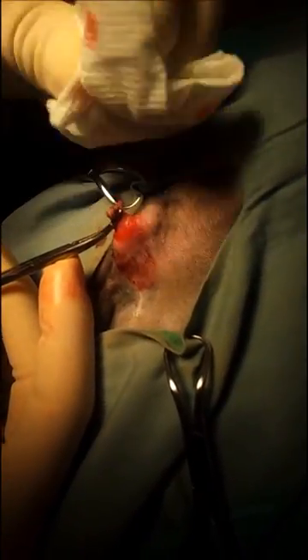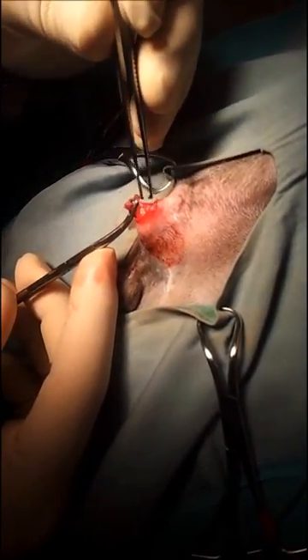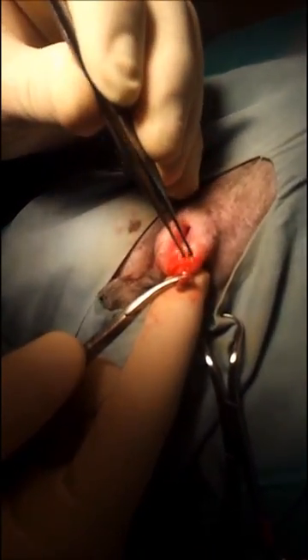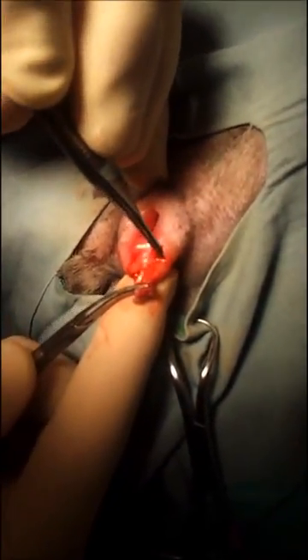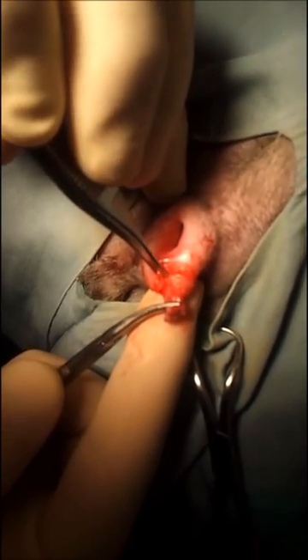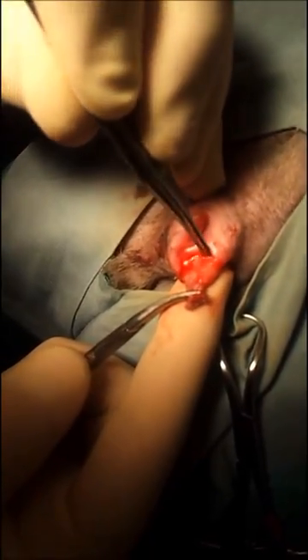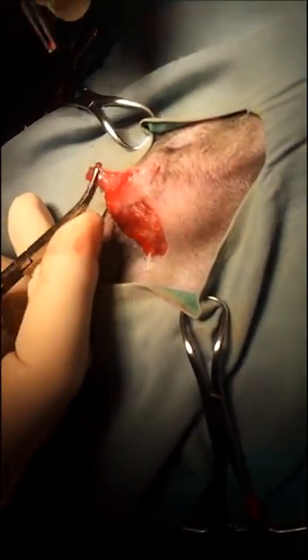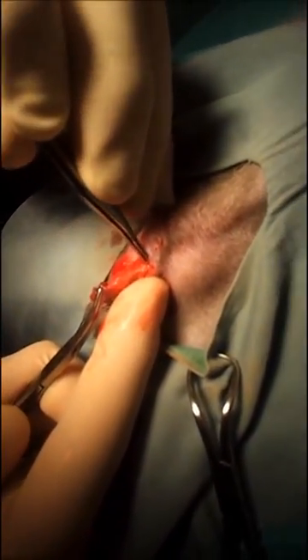I'll grab any material that's in there and throw that gauze away, and we're going to start to dissect away. I'm not sure if it's easier or harder than it looks, but you can't be aggressive — you just have to be diligent. Being aggressive means you'll break into that sac, and if you get too aggressive, then your job is twice as hard because now you're working with a broken anal gland sac. If you're a little more patient, then the ending of this procedure is much more satisfying.